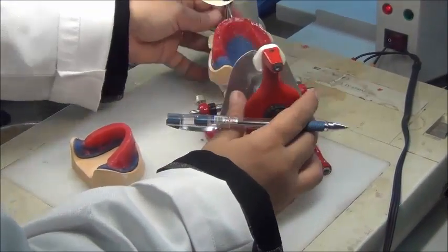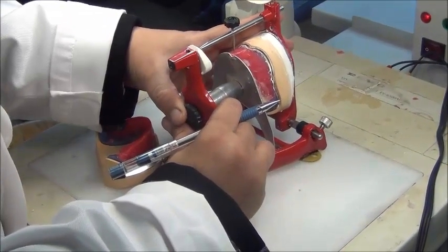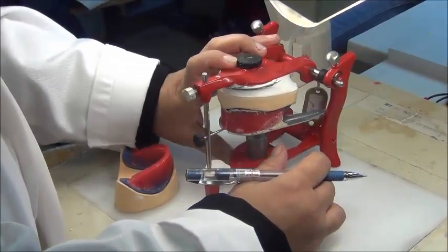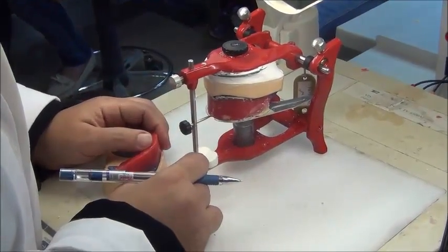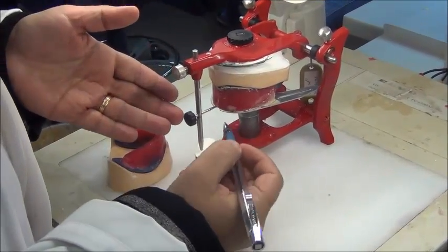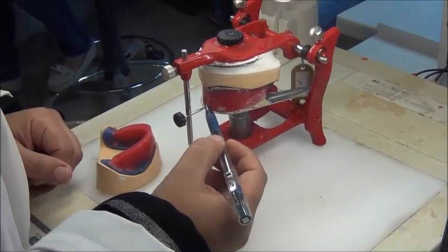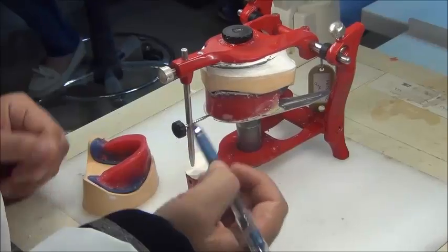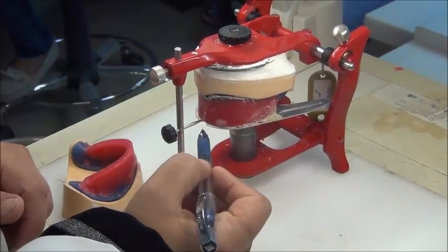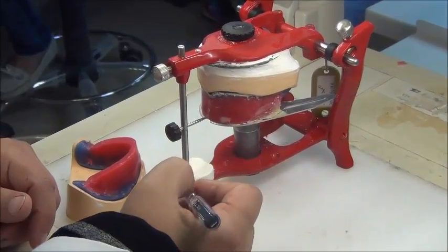So once we are mounting, we want to make sure that our mounting is correct. So what we're looking at, first of all, is the midline. Okay? So all of this was explaining only the midline. Midline of the cast and midline of the anterior wax rim should correspond with the articulator midline references, which is the notch in the jig, the pointer, or the incisal pin for the midline.